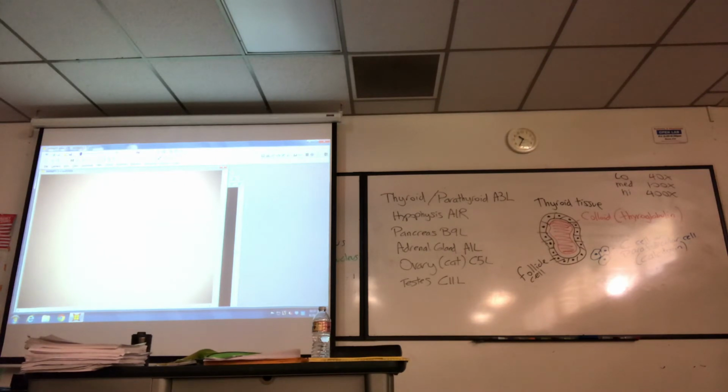Make a note to yourself on Friday's lab: get the slide that says islets of Langerhans. Some slides just say pancreas. They're not stained as well. So we're looking for the pancreatic islets.